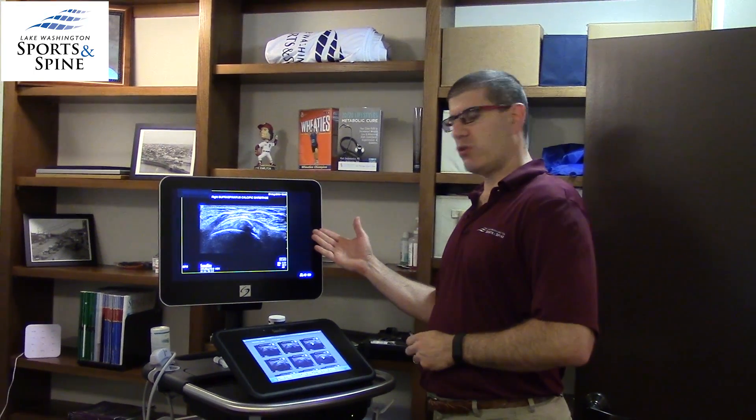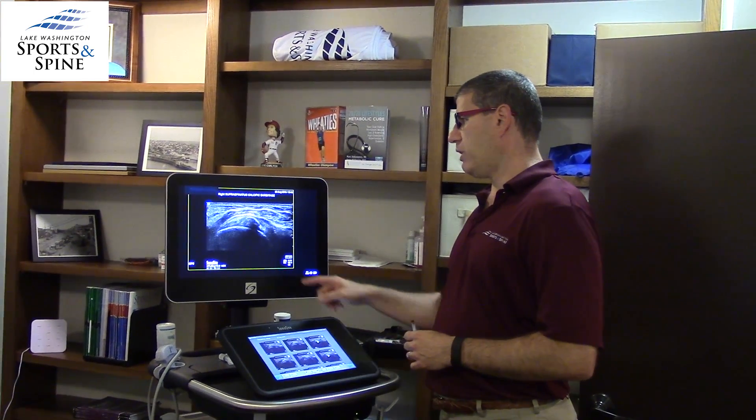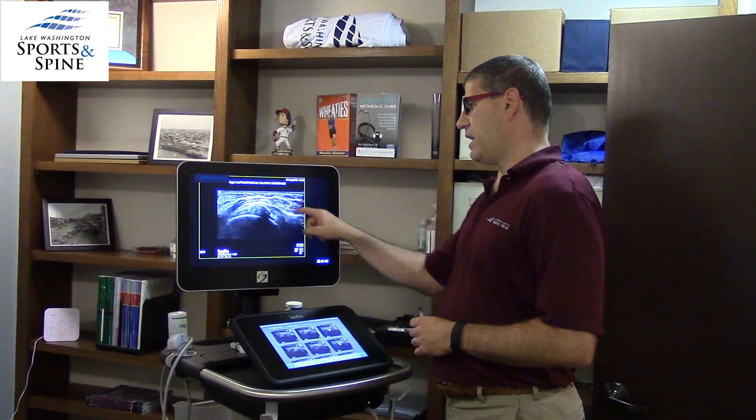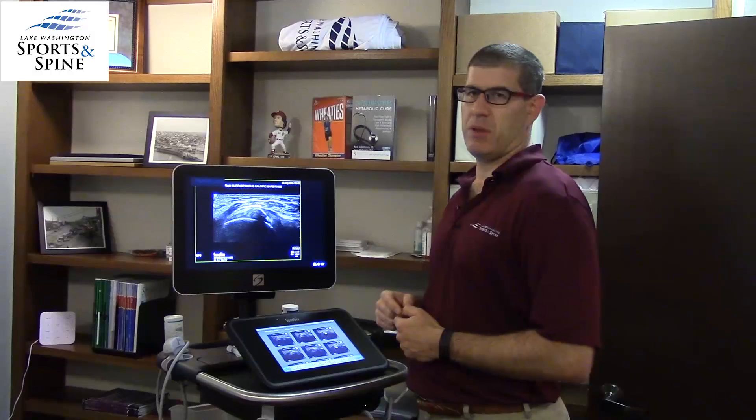What we have is a musculoskeletal ultrasound machine, and what we're looking at here is going to be the calcium deposit within the tendon. Calcium always looks white because sound waves can't penetrate through bone. This is the normal portion of what's called the greater tuberosity, which is where the tendon attaches, and we see this big deposit of calcium in the middle.